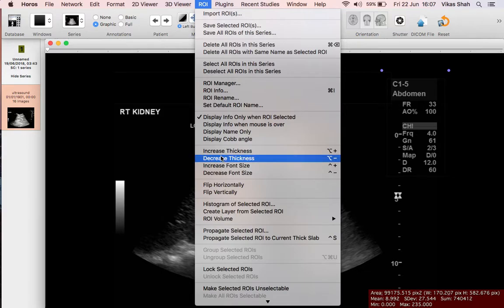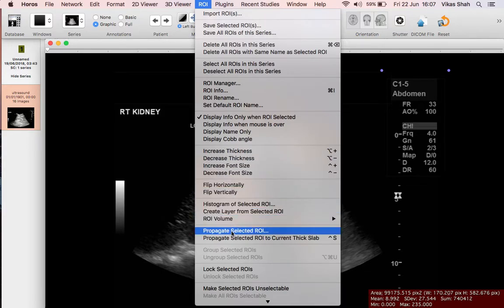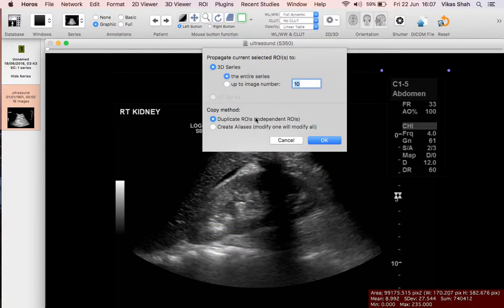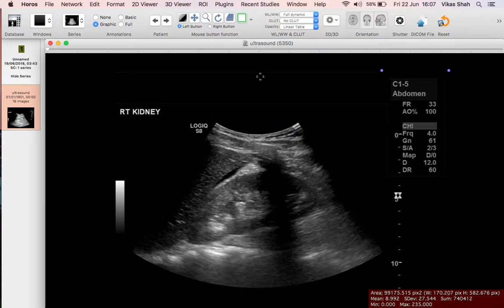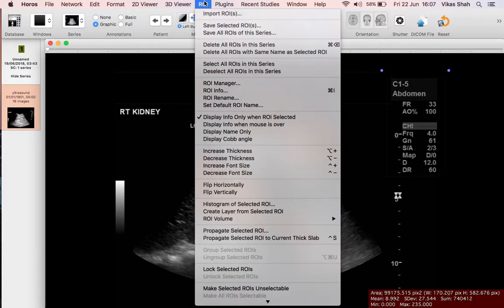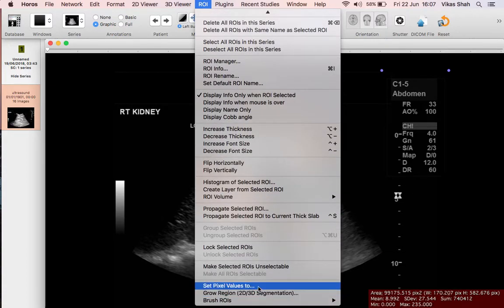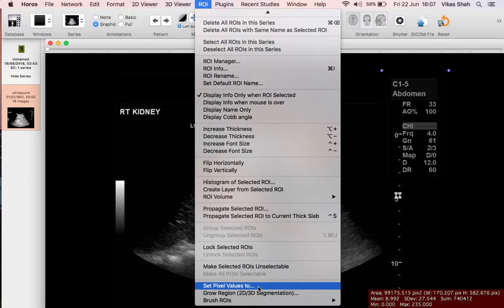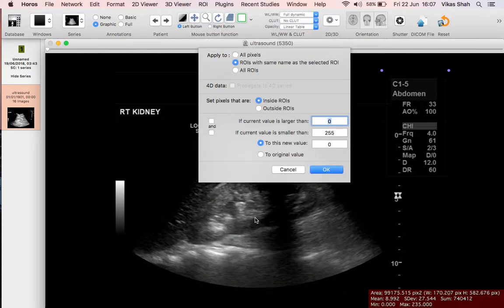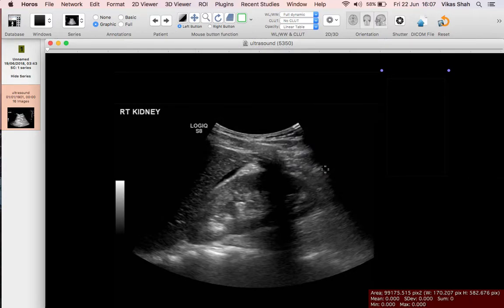We want to make sure that's applied to all of the images in the series. Go to ROI and select propagate selected ROI — it already has the entire series selected by default, so just click OK. Then go to ROI in the menu bar, go to set pixel values to, and the value is already set to zero so we don't need to change anything — just click OK. Everything inside the ROI is changed to black.